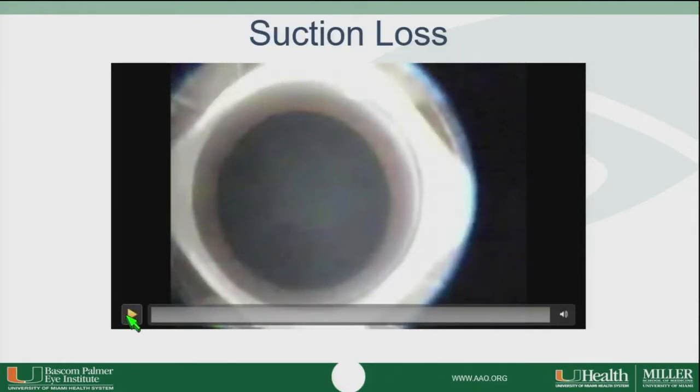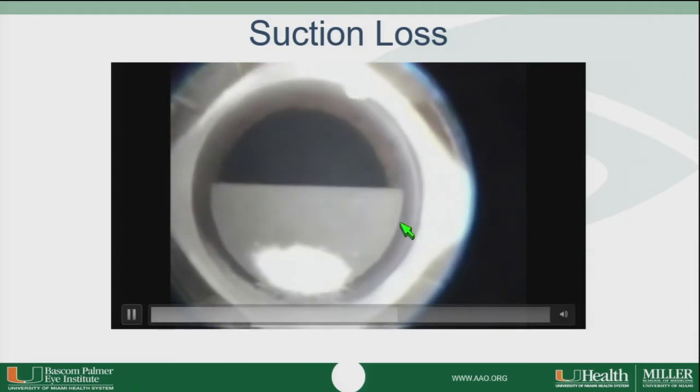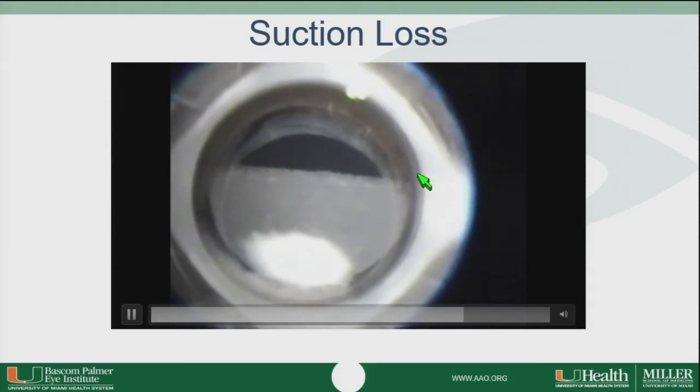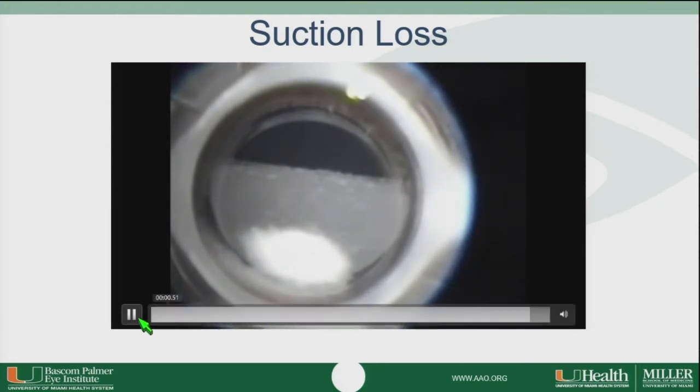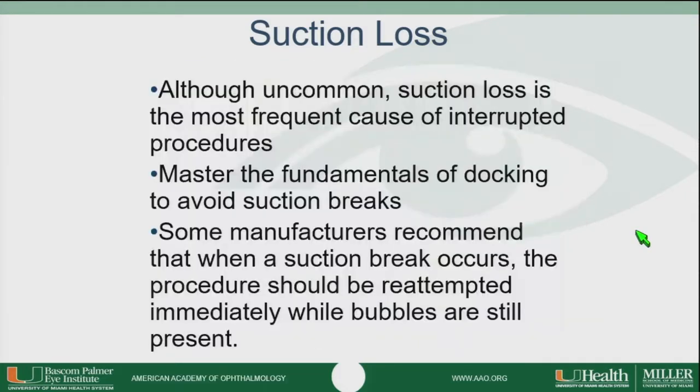How about suction loss? Suction loss is probably one of the most common reasons for interrupted femtosecond LASIK. This can occur here when you see a little pseudosuction, and depending on where the suction loss occurs, you may be able to continue the treatment and complete the refractive procedure.